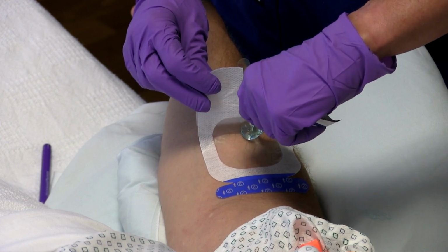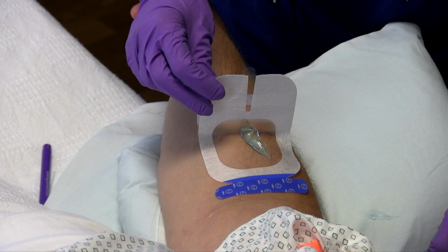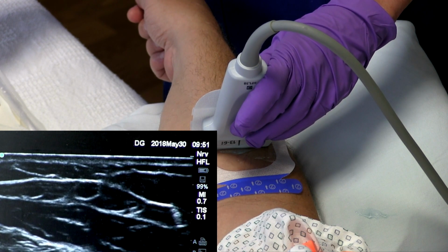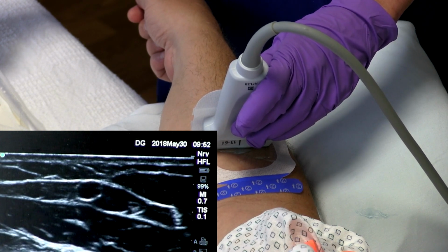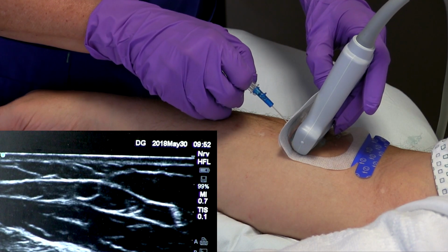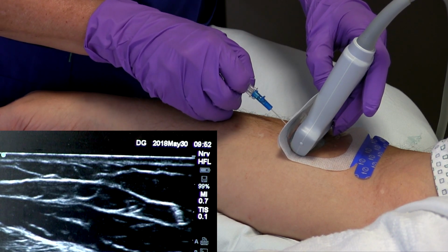Apply ultrasound gel on top of the dressing portion that's adherent to the skin. This is the non-sterile portion of the dressing. Increase the gain on the ultrasound unit approximately 10% prior to scanning through the Ultradrape. Position the probe close to the upright barrier portion to image the vein and needle insertion. Hold the barrier with your thumb if necessary.